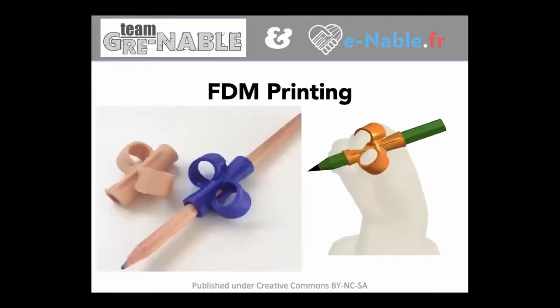Then we do some printing. So on the left, I made a blue PLA solution and a skin color TPU solution, because I didn't know at that time if the PLA, which is a solid plastic, was a good solution, or if a flexible one was a good solution. And in fact, the girl preferred the blue one.